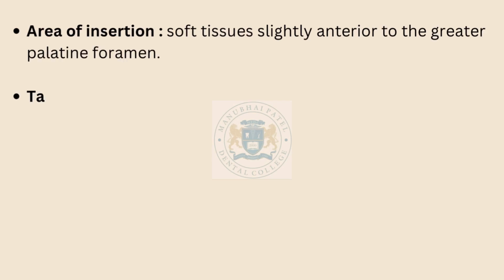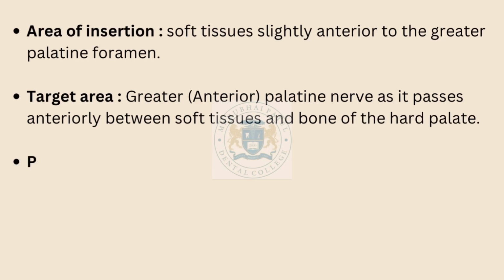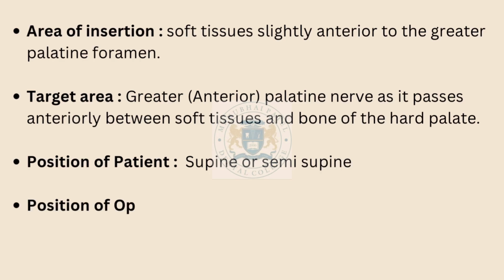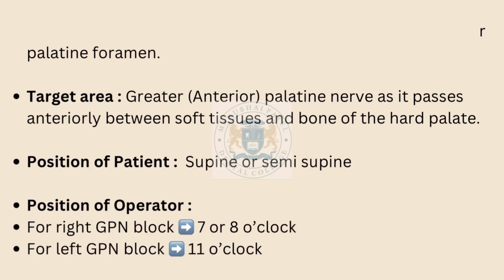The target area is the greater anterior palatine nerve as it passes anteriorly between soft tissues and bone of the hard palate. The position of the patient should be supine or semi-supine. The position of the operator is: for right GPN block 7 or 8 o'clock. For left GPN block 11 o'clock.